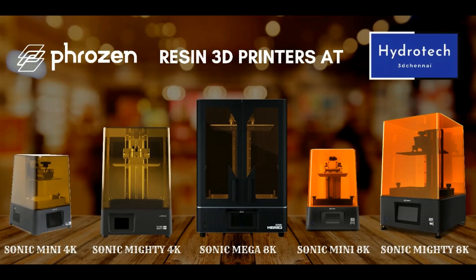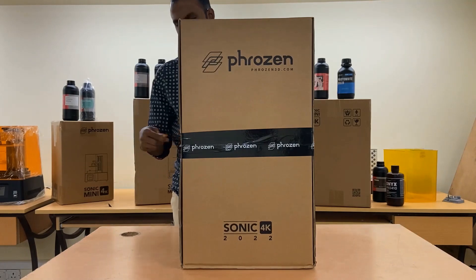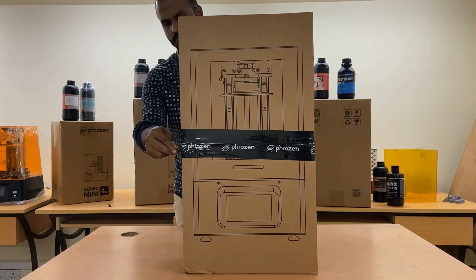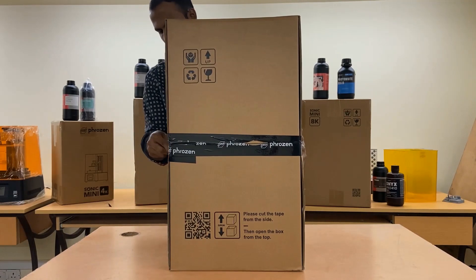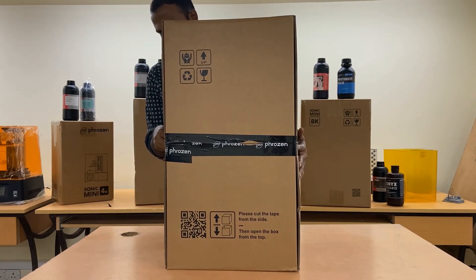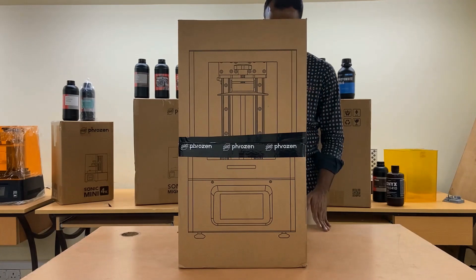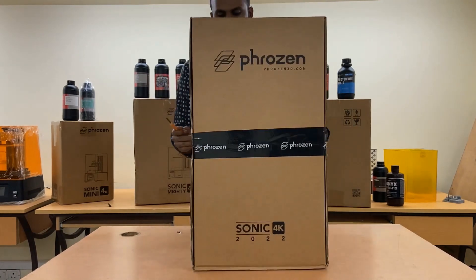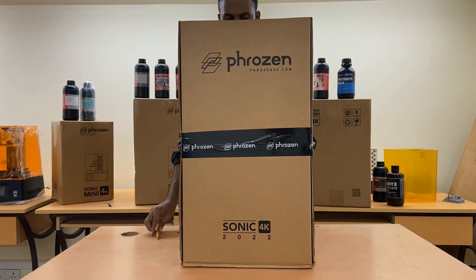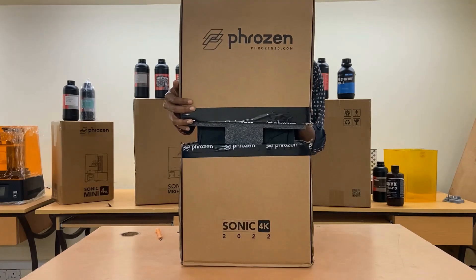Hi from Hydrotech 3D. The Sonic 4K 2022 is highly economical and 20% lower in price than other dental 3D printers.